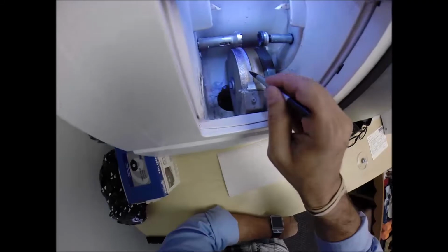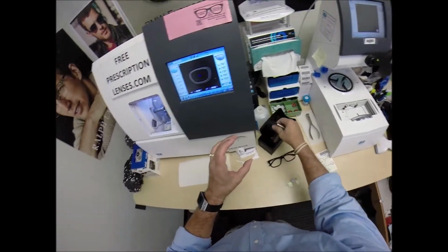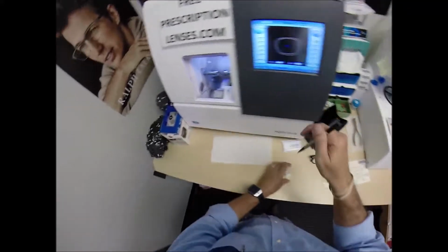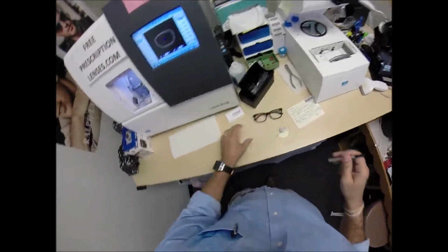But the actual cutting wheel is this diamond crusted wheel on the left. That's going to grind away your lens material from this size down to, well, that's the left lens, down to this size. This wheel in the center has that channel, that little valley in there. That's what's going to put the V-shaped bevel onto the lens so it stays inside the bevel of the frame.